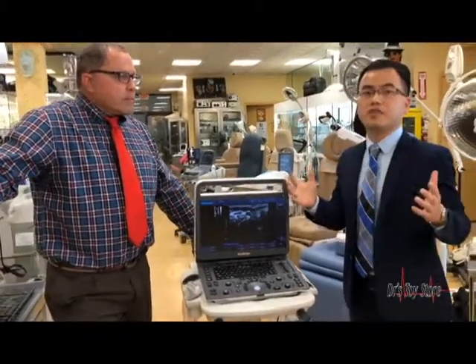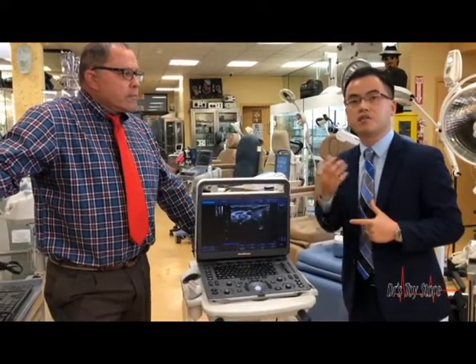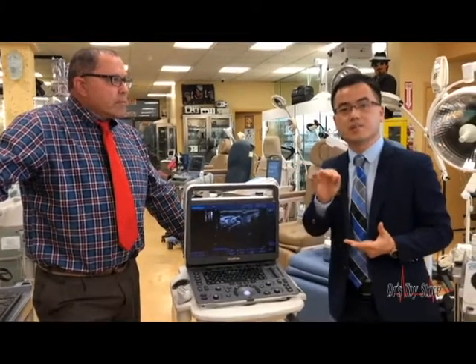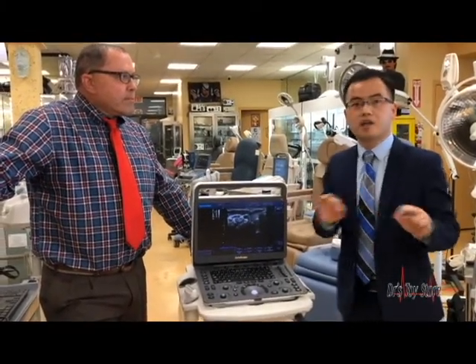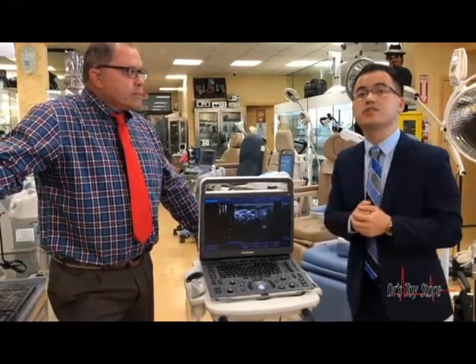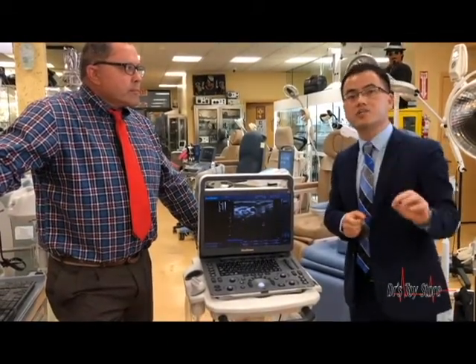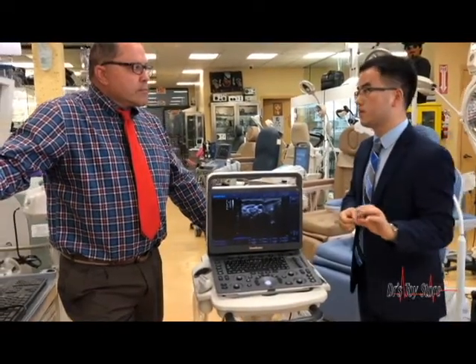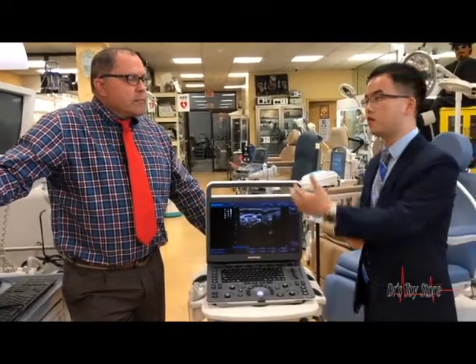The second point: if you look at the back, you can see there are three probe sockets, so you can insert three probes at one time — it gives you a very comfortable user experience. Third, even though this is a black and white system, it is built on a Color Doppler platform, so the image quality is very great, but the price point is as low as a black and white system. So these are the three selling points, and Doctor's Toy Store is our distributor.